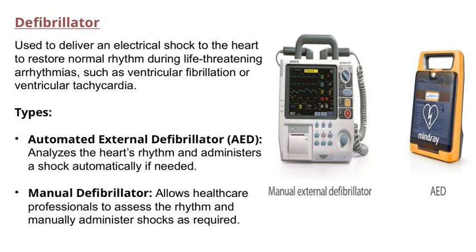Let's talk about defibrillators, which are crucial tools in emergency situations. Their main purpose is to deliver an electrical shock to the heart, with the goal of restoring a normal rhythm. This is especially important during life-threatening arrhythmias such as ventricular fibrillation or ventricular tachycardia, where the heart's rhythm becomes chaotic and ineffective.